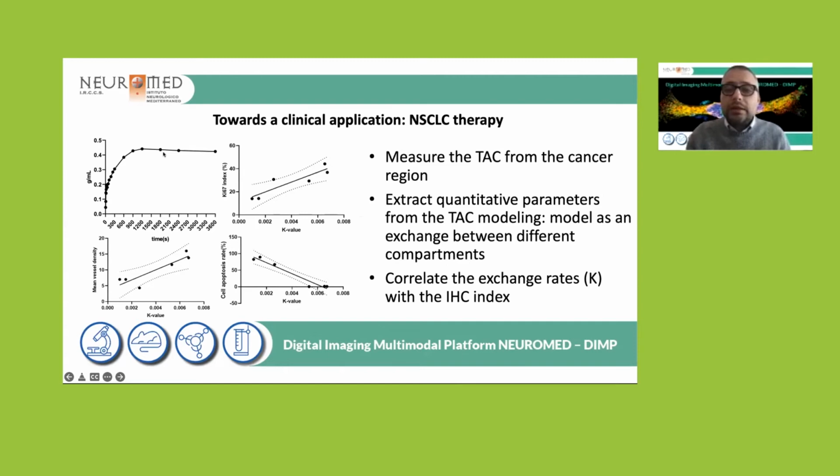In that modeling, you can find the exchange between the different compartments and correlate the exchange rates with the proliferation indexes. It is very interesting to note that the proliferation indexes correlate with specific parameters extracted from a specific modeling of the time activity curve. So PET may become quantitative. And what is important is that those quantities need to have a meaning which goes well beyond the tracer uptake.